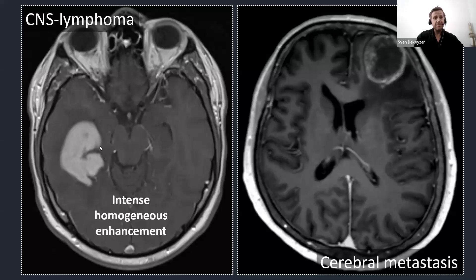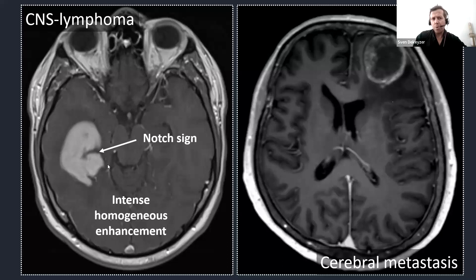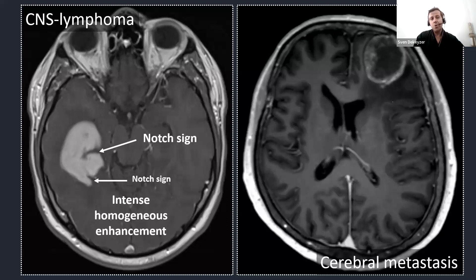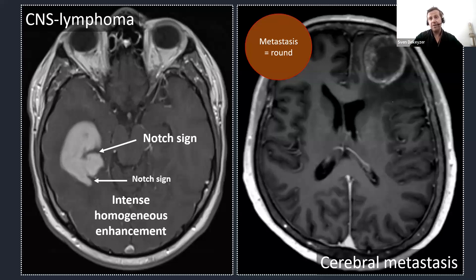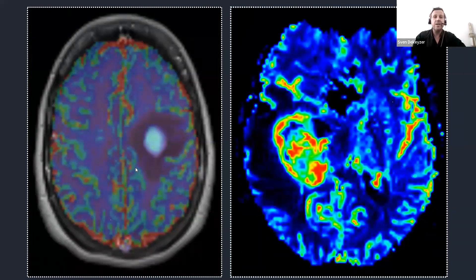Other helpful features: the tumor has intense homogeneous enhancement, contrary to necrotic metastasis or glioblastomas. Because of the bizarre perivascular growth pattern, the tumor is rarely round. It grows infiltratively, producing notches along the margins — the so-called notch sign — which we would not encounter in cerebral metastasis. Cerebral metastasis do not grow infiltratively; they duplicate from a single cell, causing the tumor to be round or globular in shape.